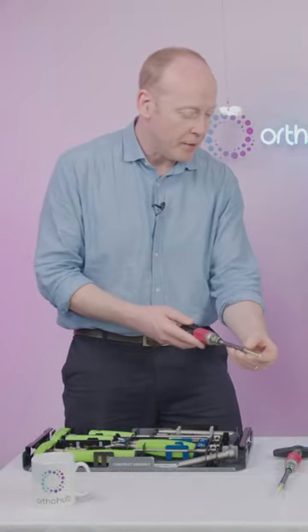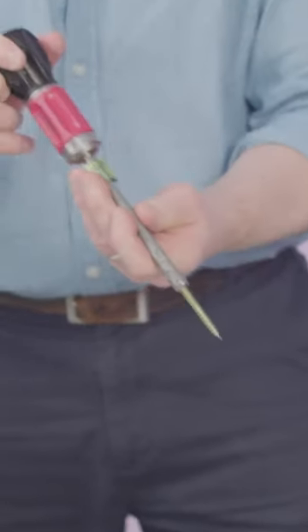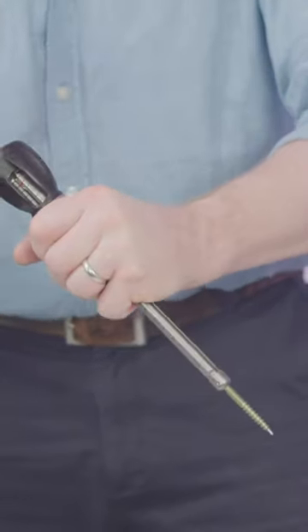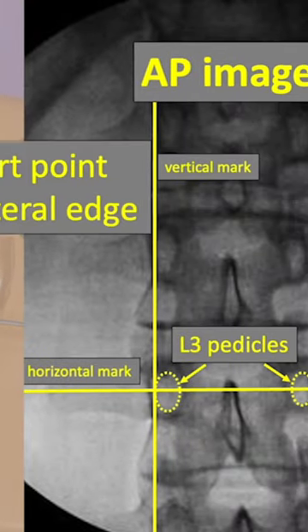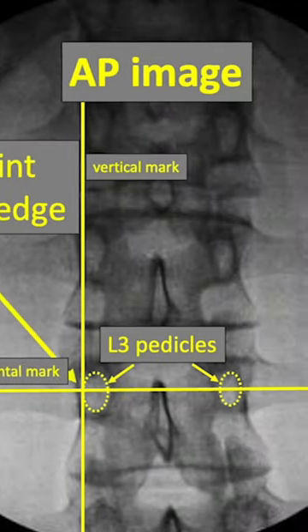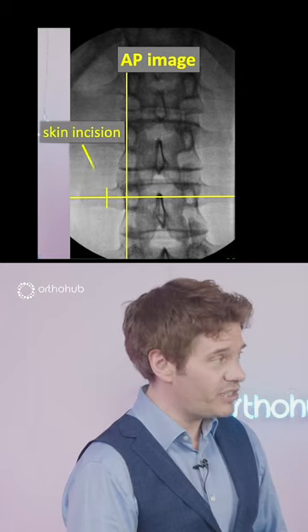So mounted up, pedicle screw with a spiky bit down the middle which is going to give us our sharp start, and we're going to tap and that gets us kicked off. And what I'm looking for is to be, as you can see on the x-ray, on the lateral edge of the pedicle that I'm targeting. And we want to be about a centimeter out from that.